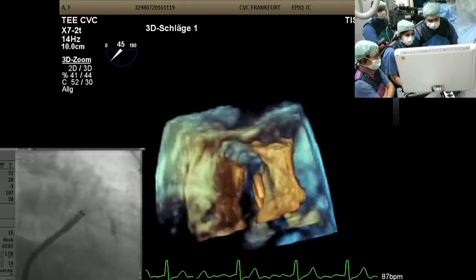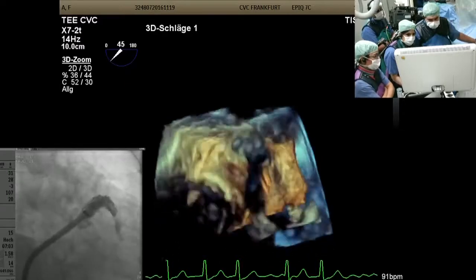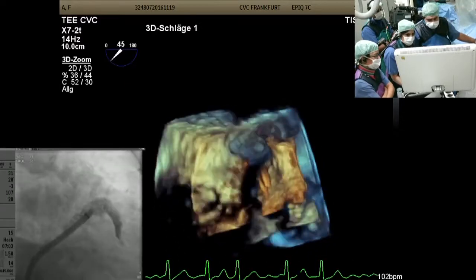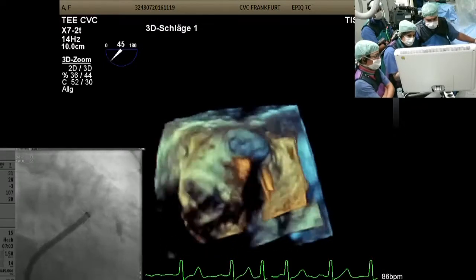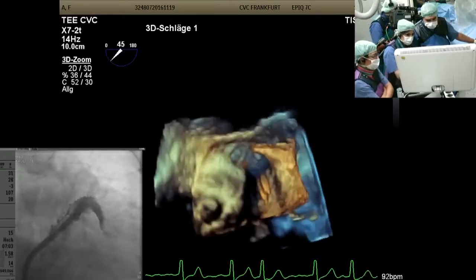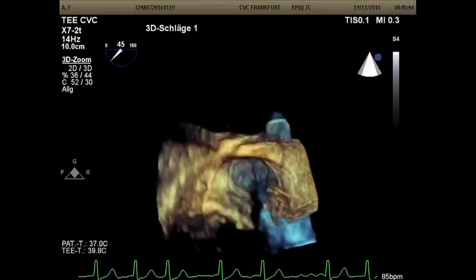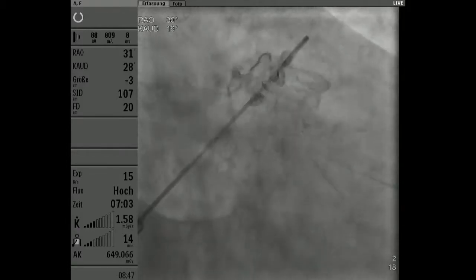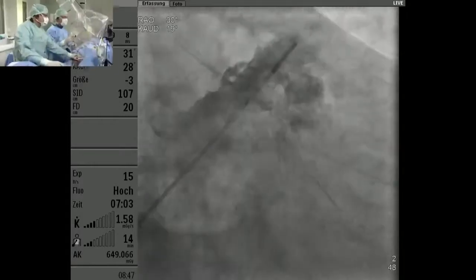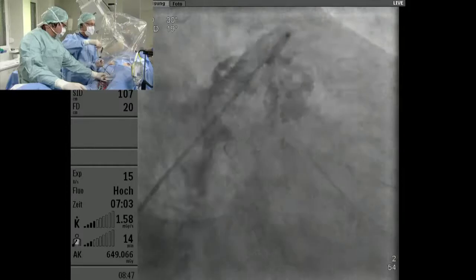Look at this very small 2 millimeter appendage Neil mentioned initially, which is so important to close, which is 2 millimeters just proximal of the distal end of the sheath. Please keep this in mind, and I will go back to the angiography we did initially, which was this one here. So, in the 3D image, can I just show the 3D image? You can just see a little bit of contrast going in.